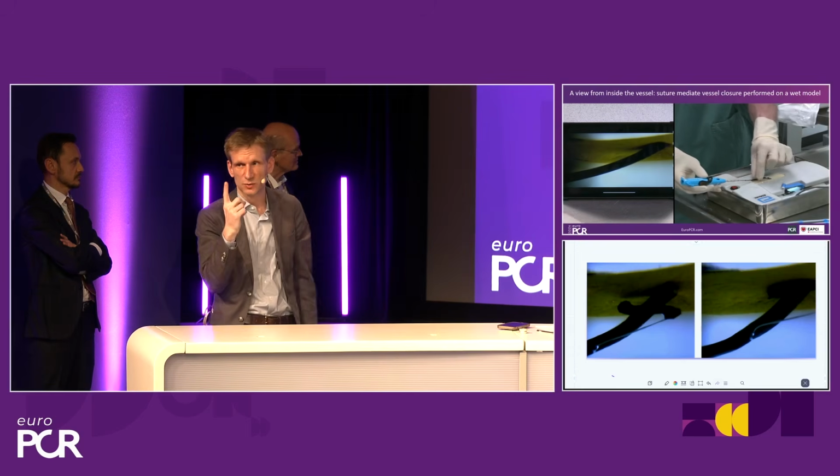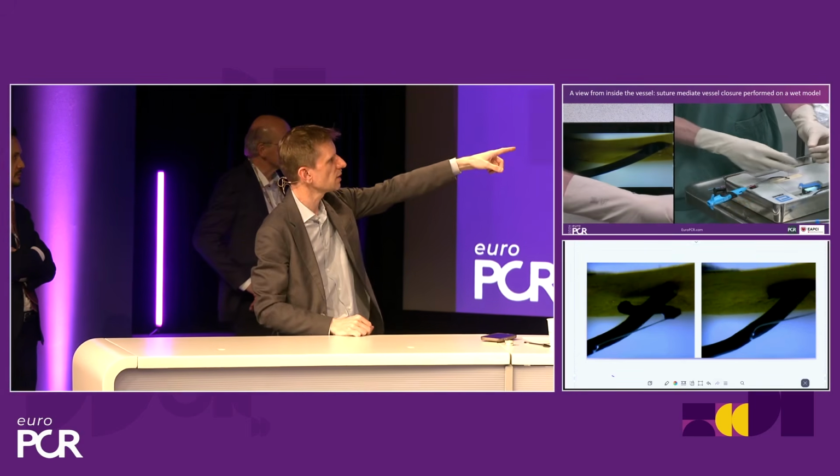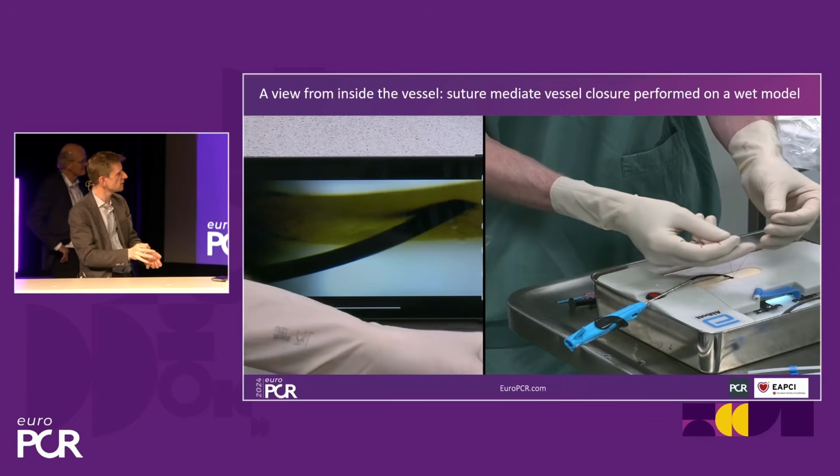Then I have one suture, but it has two ends. So I pull on that one. I already pull it in the direction of the vessel.